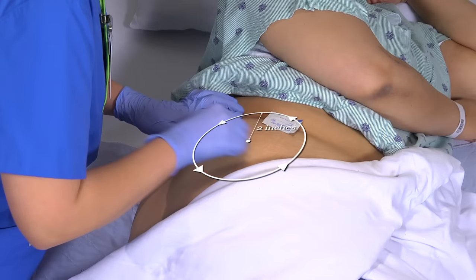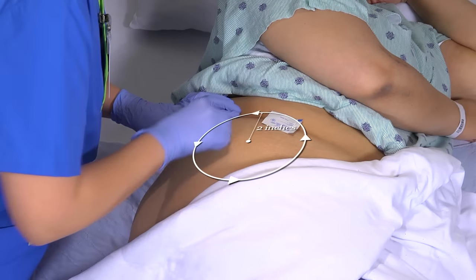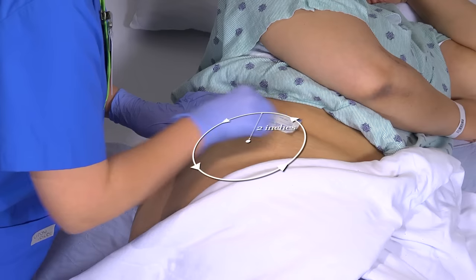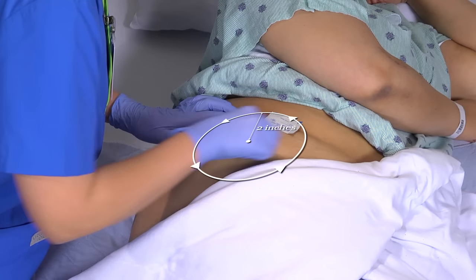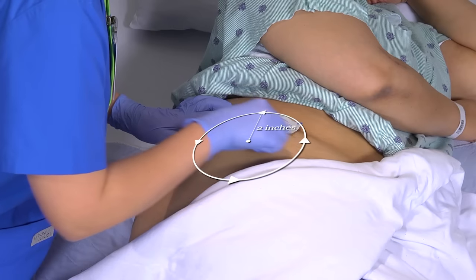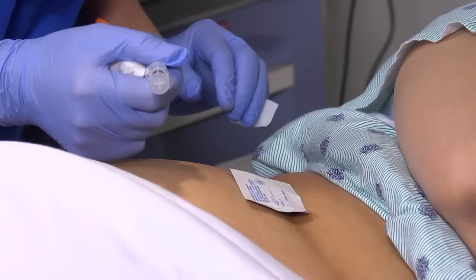To clean the injection site, begin at the center and move outward at least five centimeters, or two inches, in a circular pattern. You might want to apply an anesthetic cream, such as EMLA, to the planned injection site about one hour before you administer the injection. Or, if you use a vapo-coolant spray, such as ethyl chloride, spray it on the site just before giving the injection.